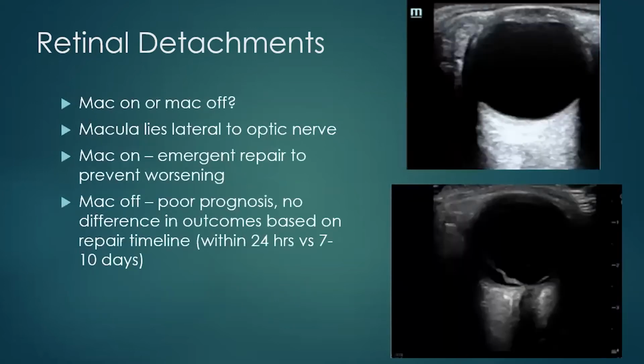When you're doing this ultrasound, again, we go through it the way I talked about earlier. Look at all these in transverse here. A really important part of evaluating this is what part of the retina is attached. You'll see the retina here is going to be this hyperechoic, somewhat thick part right there at the back of the vitreous. One thing you'll importantly see is that no matter what part of the retina is detached, it will always be tethered here at the optic nerve.